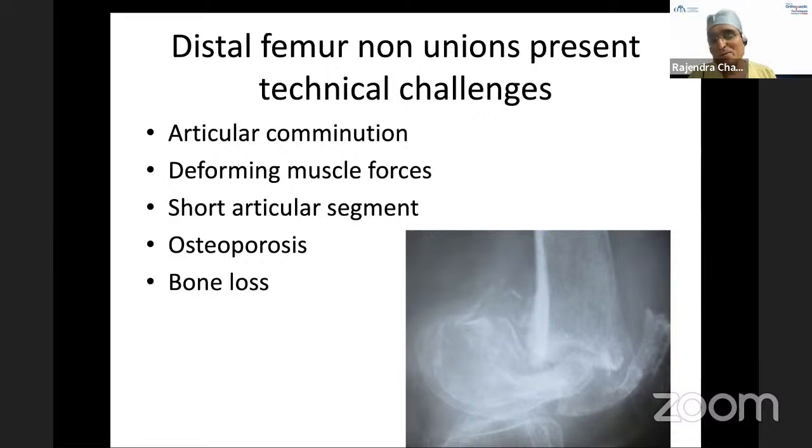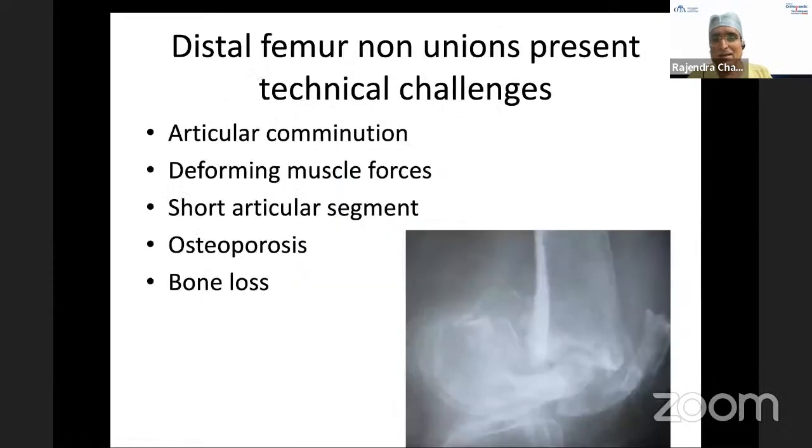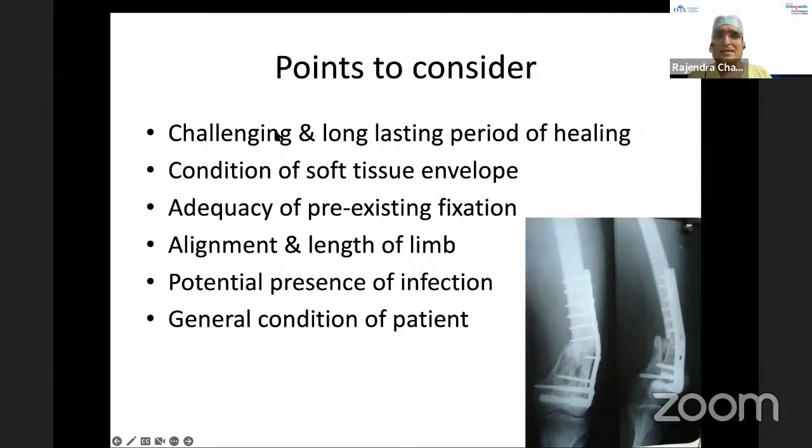So what I'm trying to postulate and present here is different types of supracondylar non-union. One cookbook is not available. You have to plan what is needed for that particular case. So in this case, the problem is articular comminution, very strong deforming forces, a very short articular segment, osteoporosis and bone loss. In this case, the situation is much better, where the mechanical forces have given way. The choice of implant is not good. And here correcting this non-union possibly is much easier than the previous non-union.